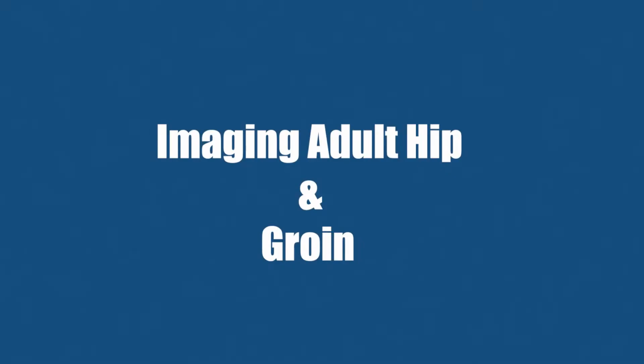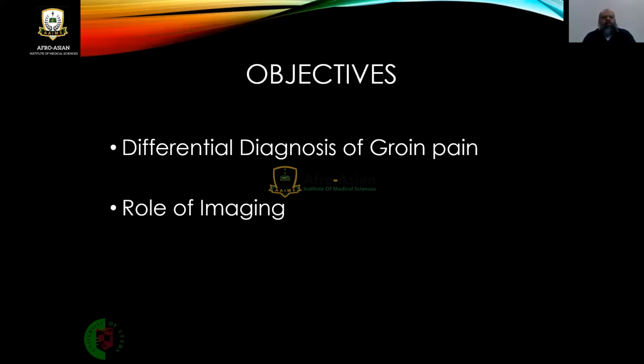Imaging adult hip and groin. The objective of this presentation is the differential diagnosis of groin pain and the role of imaging in groin pathologies and the adult hip.